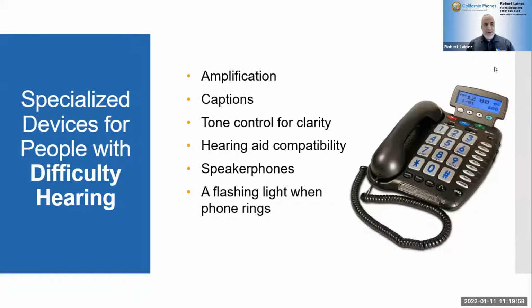So in speaking with phones that are for people who have difficulty hearing, we have phones that are amplified. And of course, what does that mean? It means that not only can you raise the volume so you could hear also.